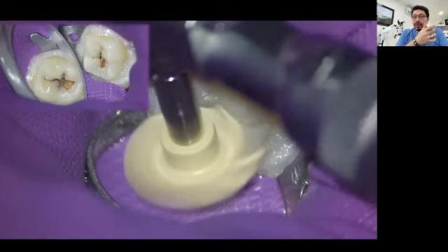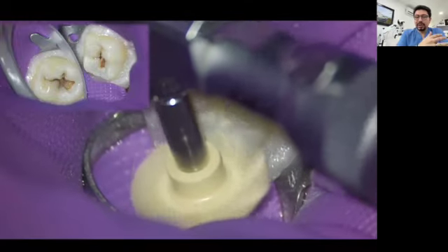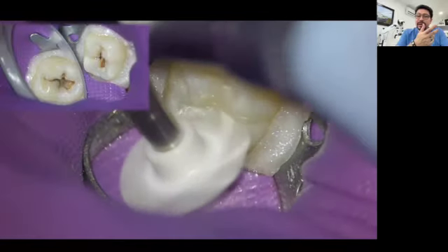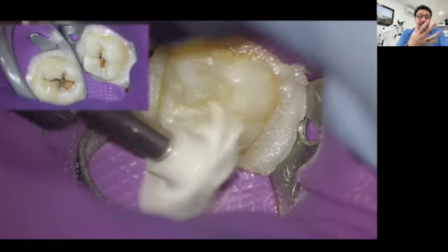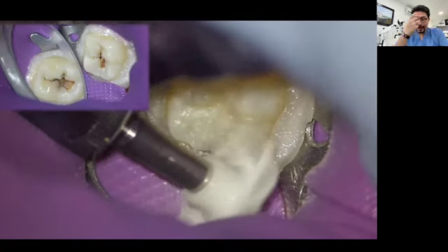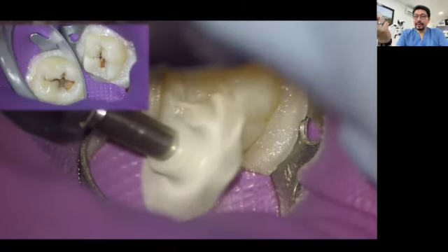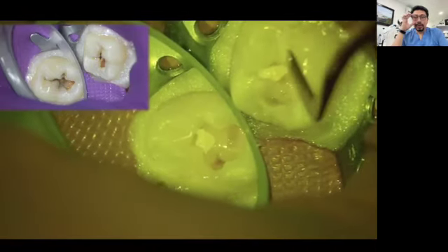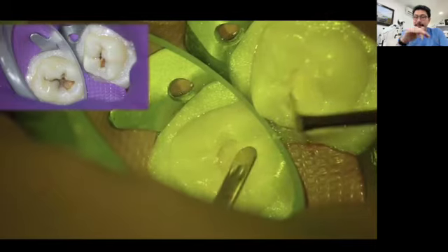And the microscopes also come with a green filter. The filter helps to see blood vessels and is mostly used for surgical procedures. But the orange filter, it's very useful. And nowadays that we are implementing more and more the laser in endodontics and the erbium laser in dentistry in general, you can also adapt a filter for laser to your microscope. And you won't need to use the glasses for the laser because the microscope can have that filter as well.